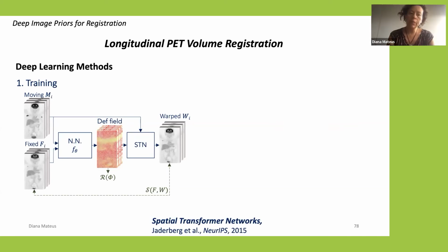So what is happening in the deep learning world with respect to registration? We are at the moment where we are only starting to reach the same level of performance. And this is one of the topics where, unlike segmentation or classification, deep neural networks do not yet outperform the other approaches. Here we are not at that stage yet.